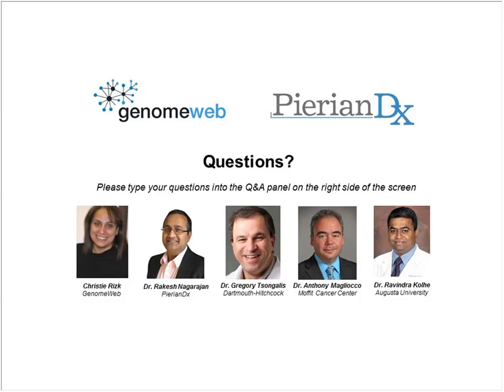Remember, this is not an analysis that's an FDA-approved device. It really needs to be validated within individual laboratories. But yes, I think the evidence is very good to replace the current approach to MSI with this more comprehensive assay, and appropriate diagnostic samples will need to be validated within each lab to do that.